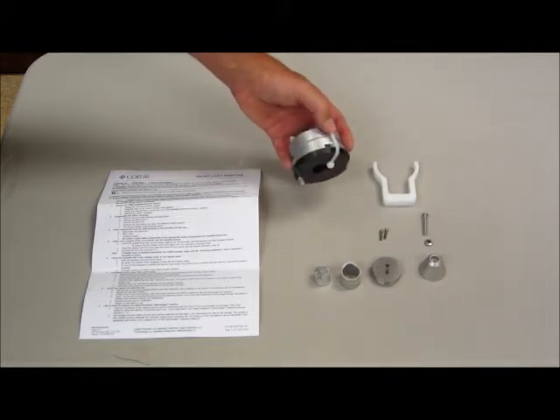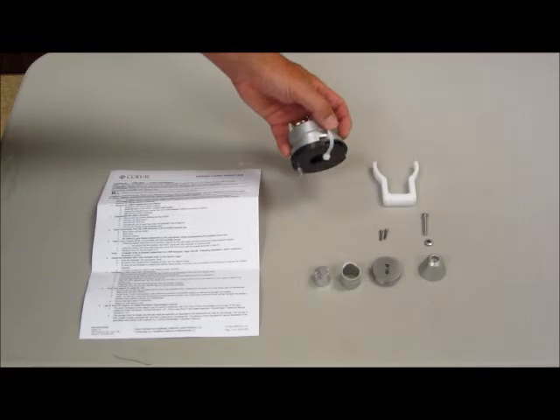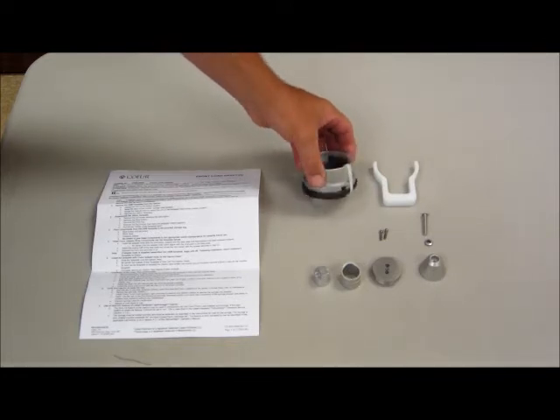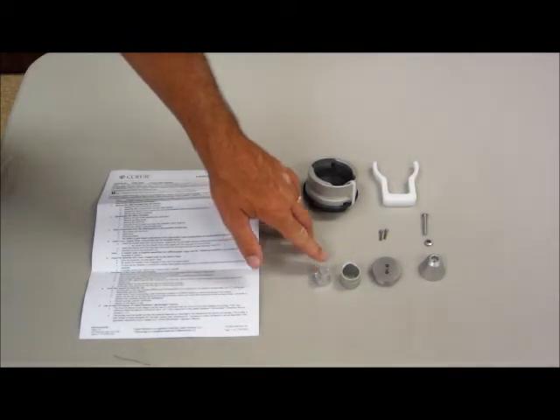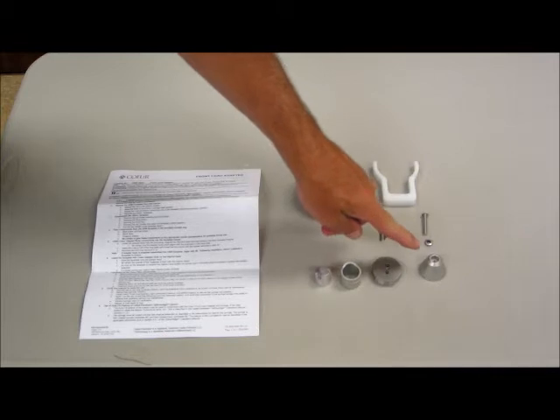The wire tie on these two is to keep them in correct orientation during shipment. This wire tie needs to be removed as you begin the assembly of the adapter onto the injector. You have the RAM extension, the RAM sleeve, the RAM tip, and the cone.